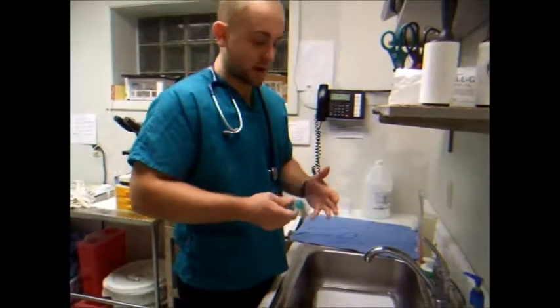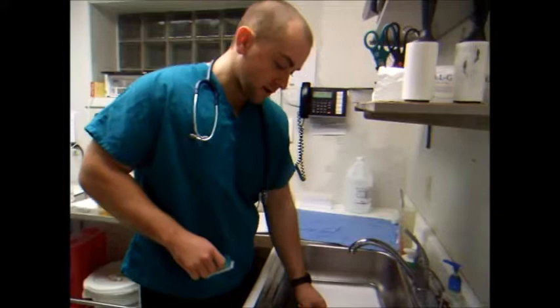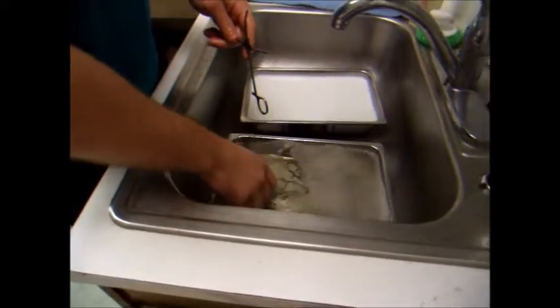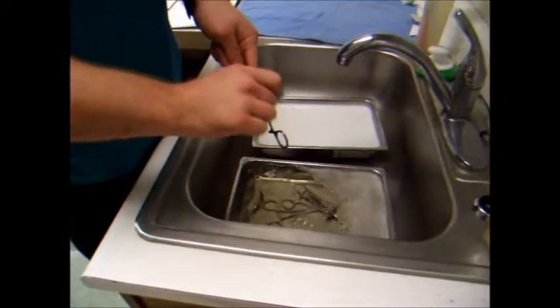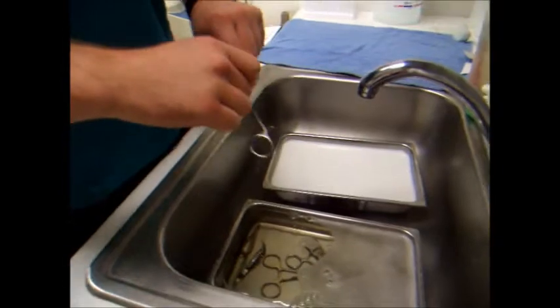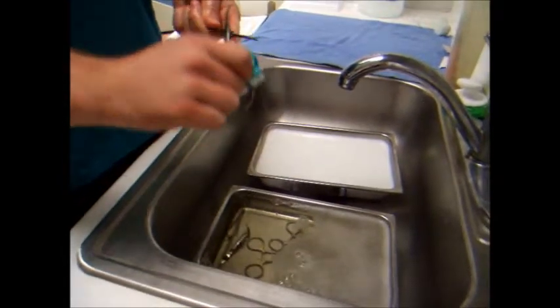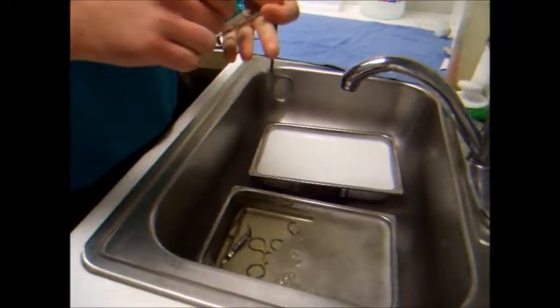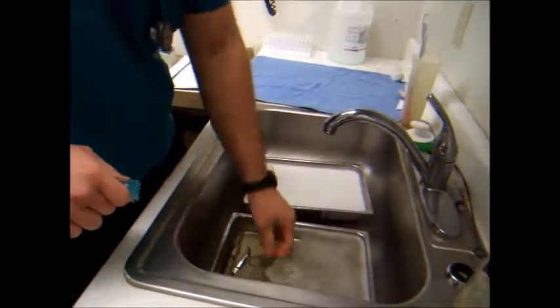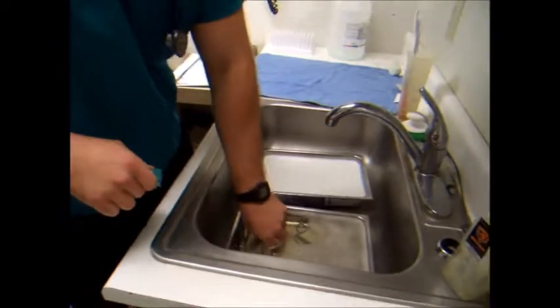I'm going to demonstrate how to properly clean our instruments here. They've been sitting in the cleaner for about 15 minutes now. So we're going to go ahead and scrub it with our little scrubber here. Make sure we get all aspects of the instrument. And then we're going to put it into the lube for another 10.